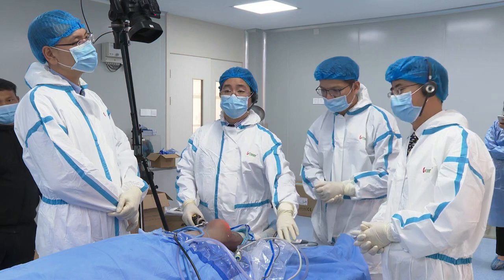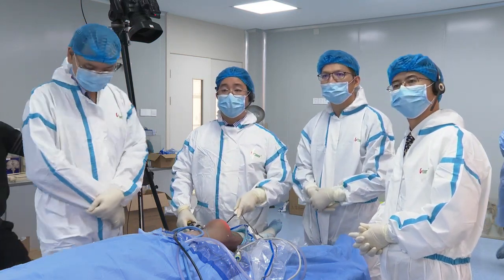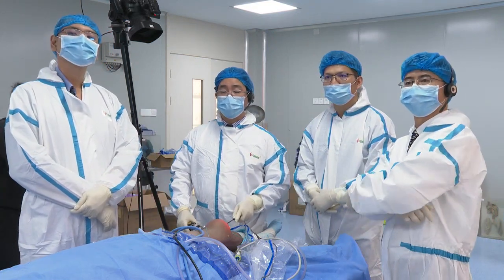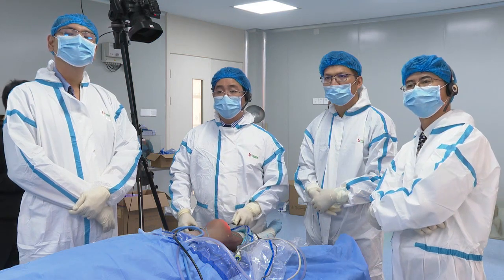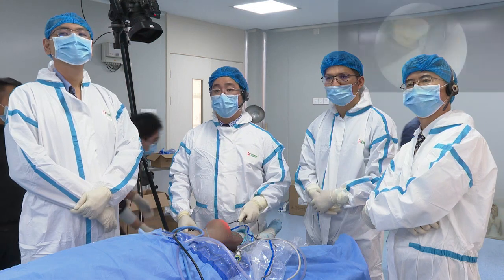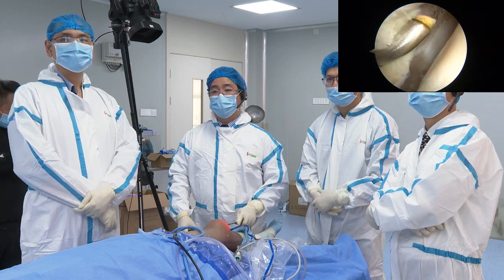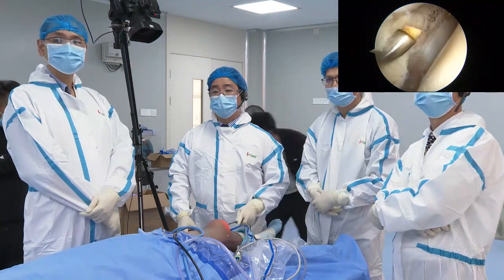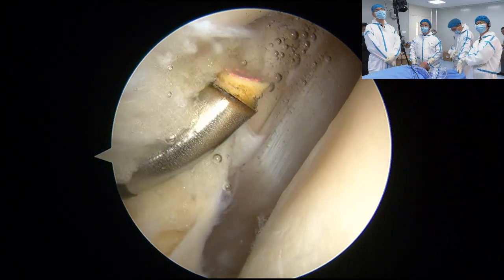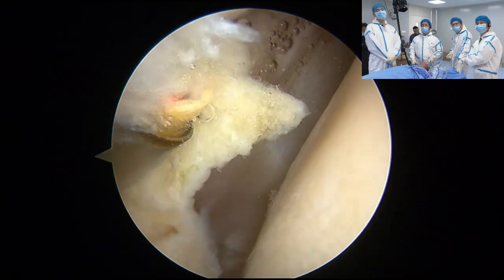Yeah. So most of the time, in my technique, I flip the graft. Most of the time, I put it 8 strands, 8 strand reconstruction. So the tibial side is always bigger than the femoral. So let's say you have femoral 9, the tibial will be 10. It's always one size bigger, right? In my practice, in my opinion. So it's rare that the tibial size is smaller than the femoral side.